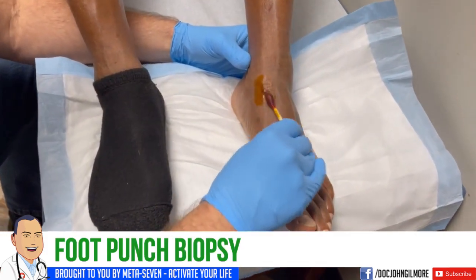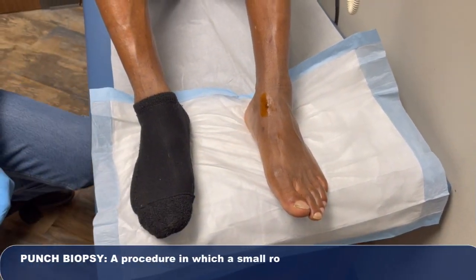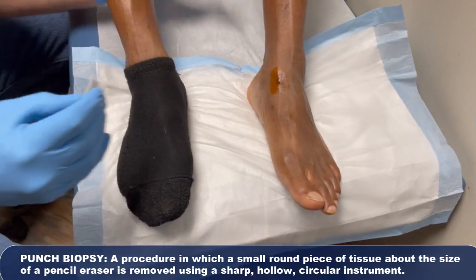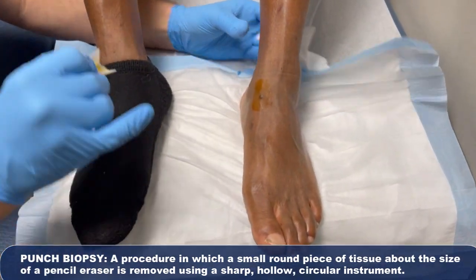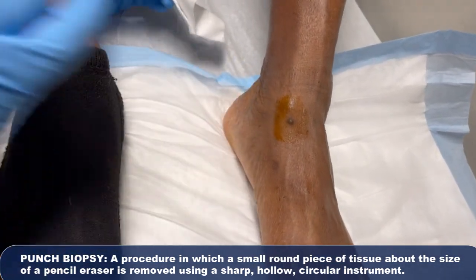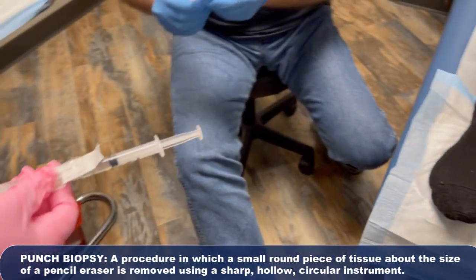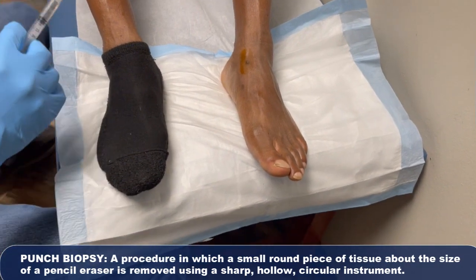So we can get a microscopic evaluation, find out what this is. It's dry, kind of scaly. It's not terribly irregular, but it does have a little bit of central necrosis there, which is always a little bit concerning when you have a lesion that's got a sort of a non-healing center to it.